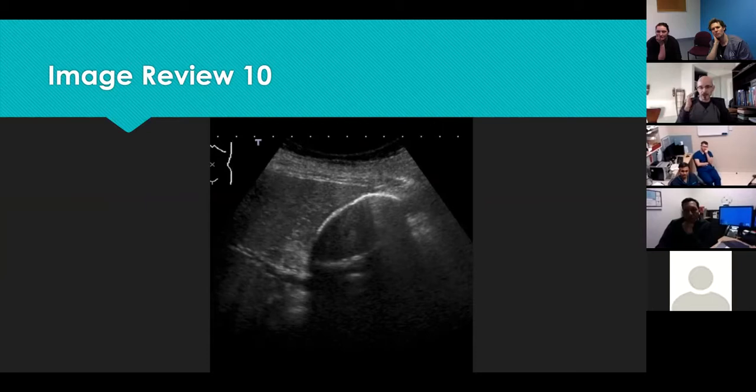Then you want to have a long view of the gallbladder with the gallbladder neck in view, in the supine position or in the semi-lateral position. Then in the same initial position, you want to have two transverse views. One is the fundus of the gallbladder, the other one the neck. And then you want to move the patient towards either a standing or sitting position and have another long view. And then your CBD, and that's pretty much it. So that's about 10 images or so in total? Yeah, 6 or 7 images, yeah, 10 images.